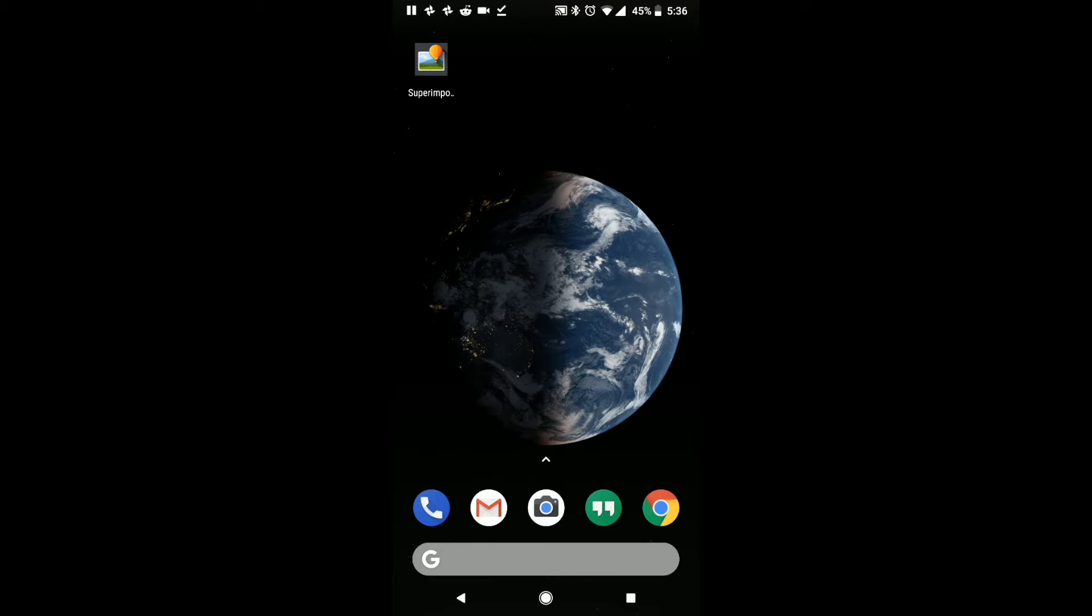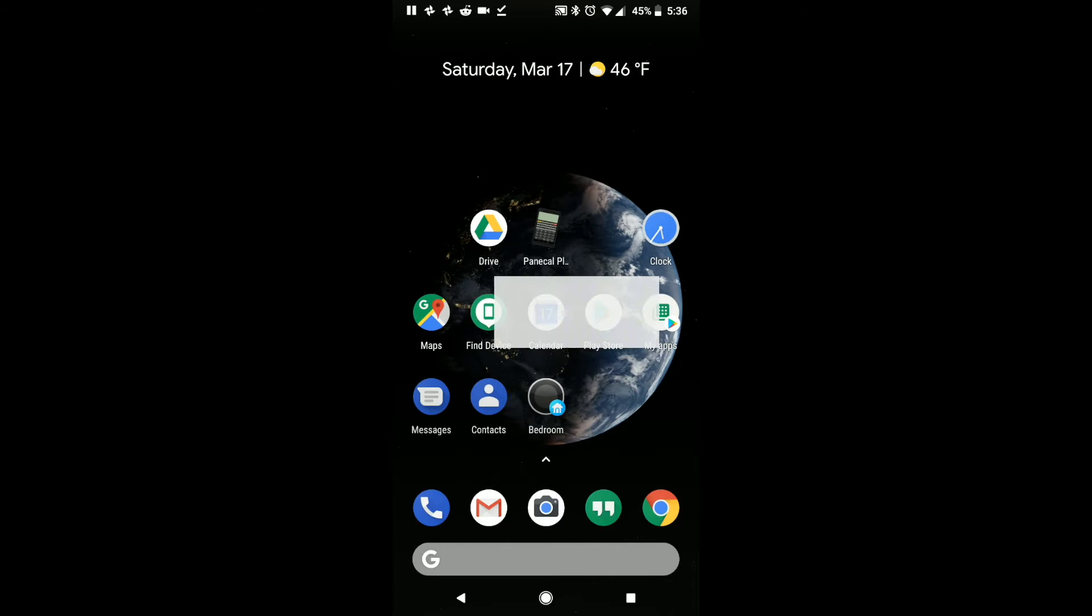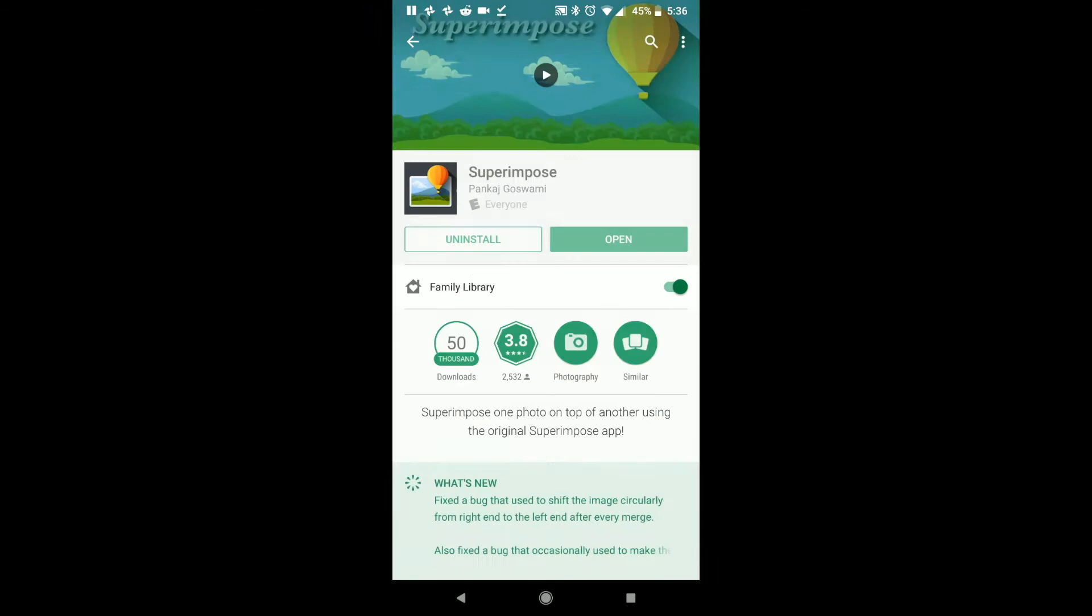The App Store is really similar. And if you just search Superimpose, then it brings up this app, and this is the app that you want to download. Anyway, I've already downloaded it, and you see it's on this screen here.